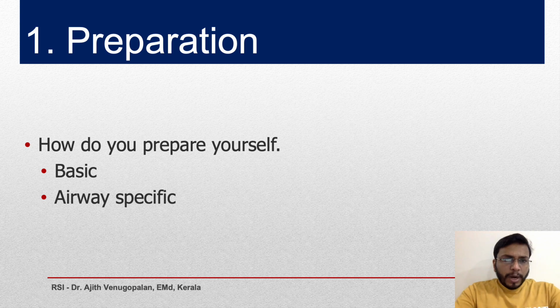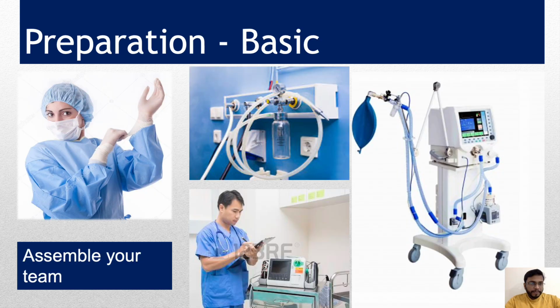We'll go to step 1, that is preparation. How do you prepare yourself for any such situation? Preparation can be broadly divided into basic preparation and airway specific preparation. Basic preparation starts with PPE: your mask, your gloves, your gown, your cap as required, and goggles as required. Then you should have all the basic monitors prepared.